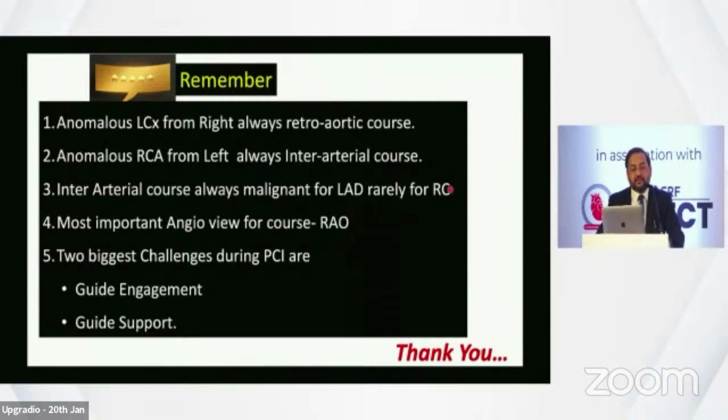And the two biggest challenges of such PCIs are guide engagement and guide support, but that can be overcome by a little bit of wisdom, experience, and a little play of hands. Thank you.